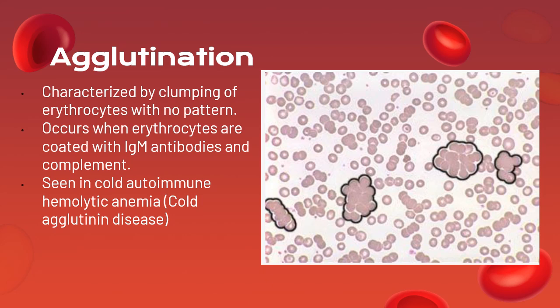Sometimes, we can also see agglutination when the extraction is traumatic. For example, you had difficulty, it took you long in the venipuncture, and you repeatedly pulled the plunger. It speeds up the clotting of our blood, and then when you finally get the blood, there are microclots. So, best is if in doubt about the extraction, for example you had difficulty, just draw again, so you are more sure.